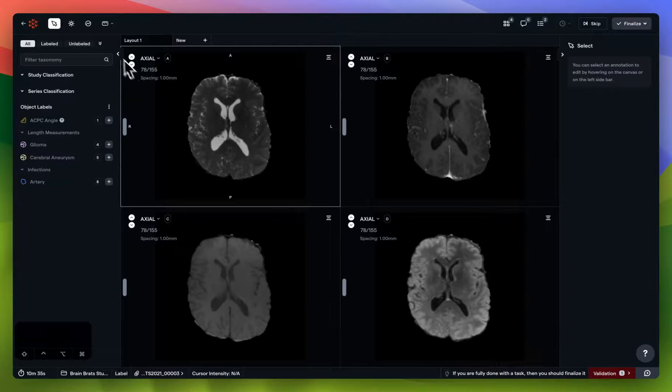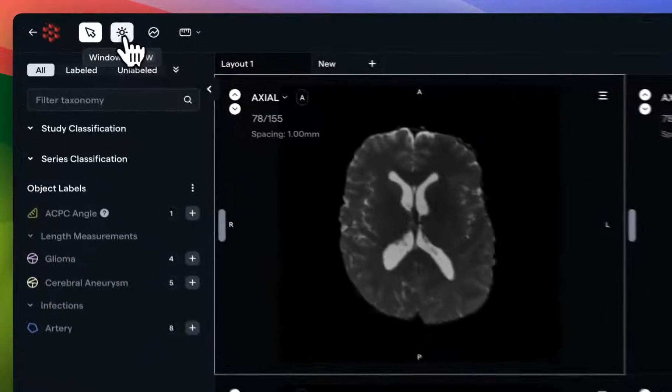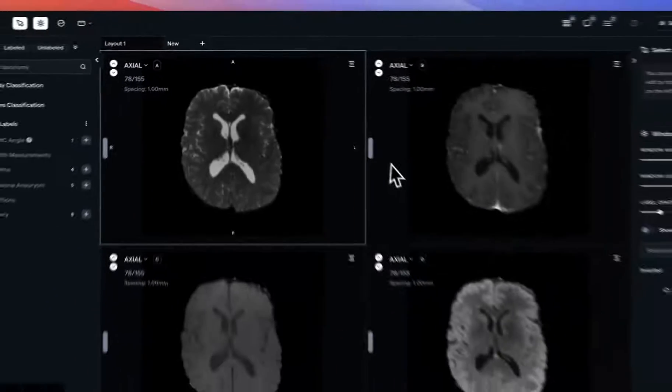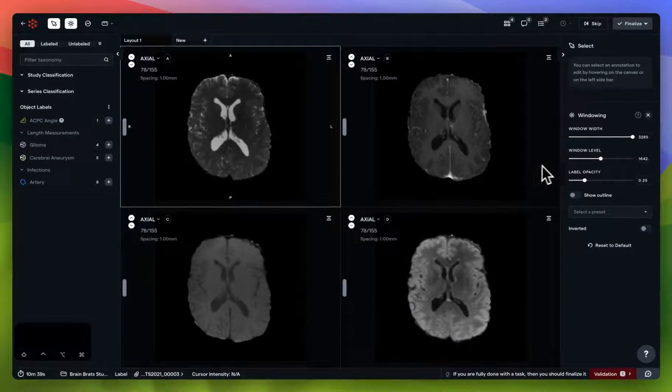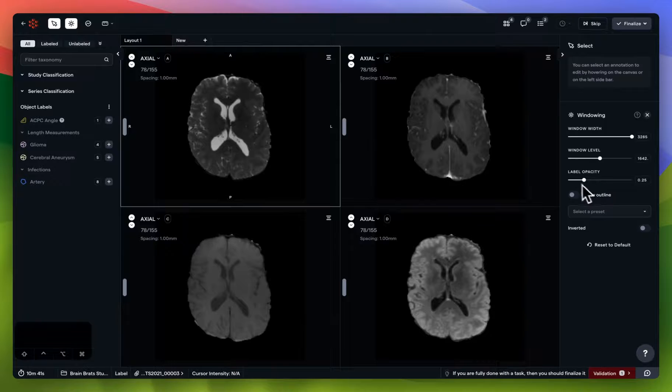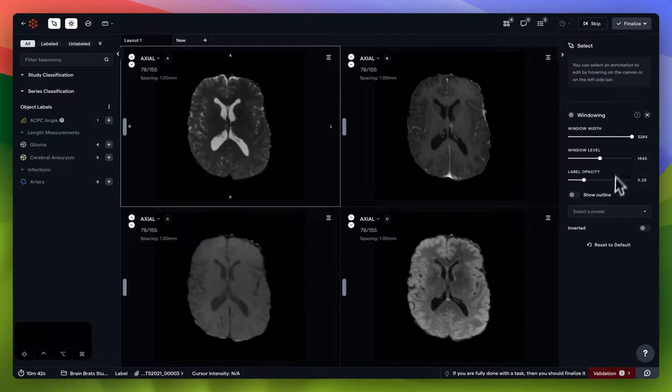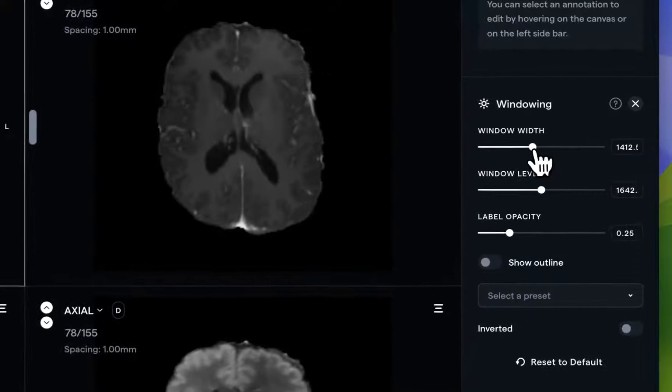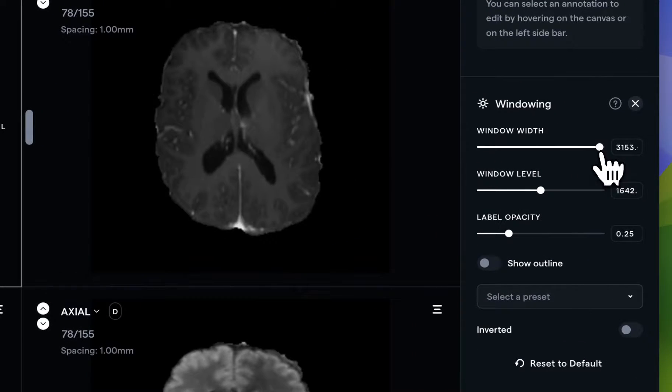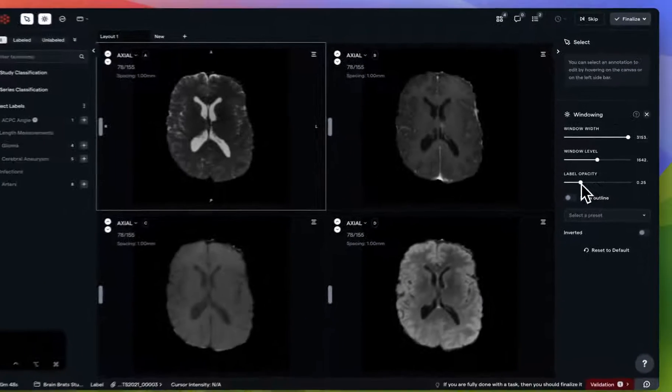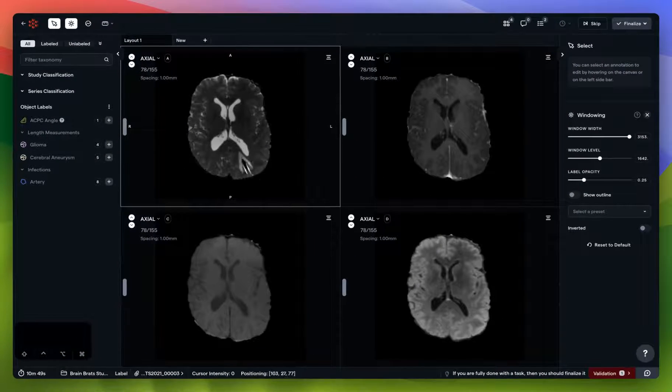Our first environment setting is windowing, which is located in the top left corner. When I click on it, the context panel displays on the right, where I can easily regulate the width, level, and label opacity for whatever viewport I have currently selected.